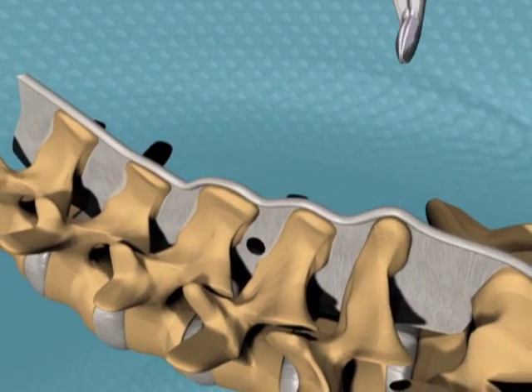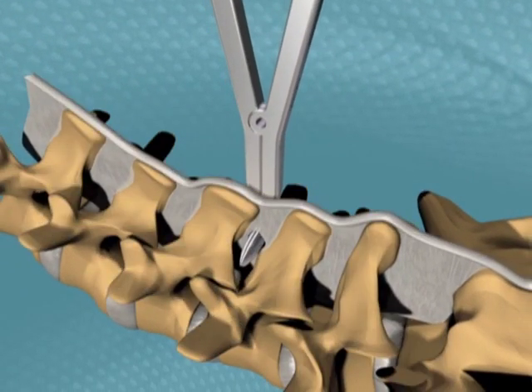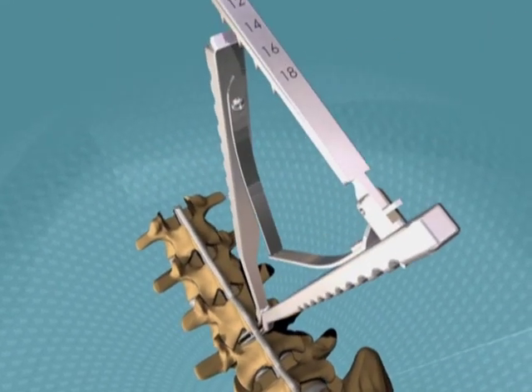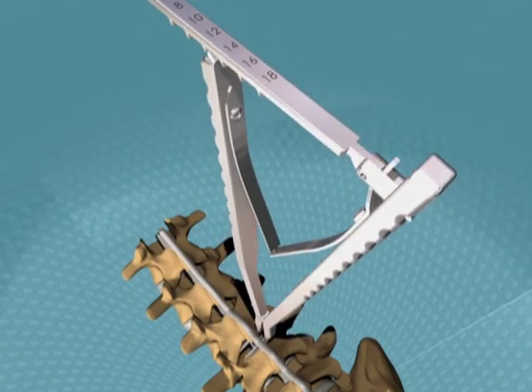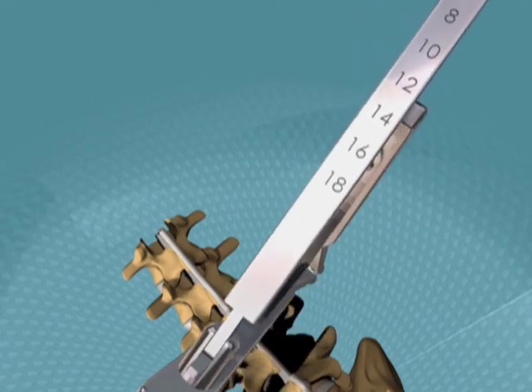Using the spreader, determine the appropriate size of implant. Insert the spreader with the ratcheting arm open and compress to feel the tension. Once the desired tension is reached, close and lock the arm. The placement of the arm will indicate the size of the implant needed.